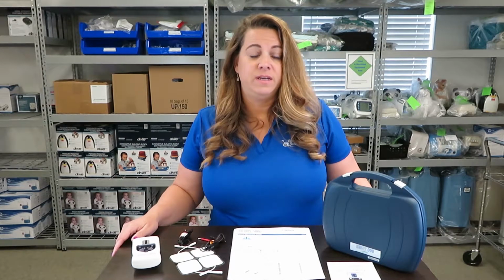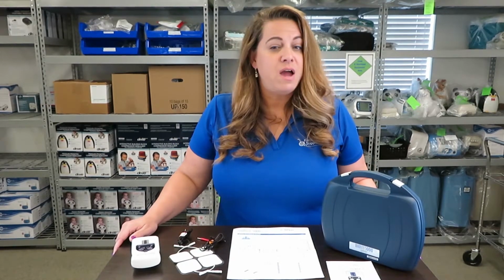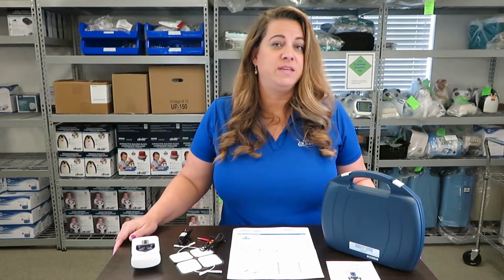Do not place electrode pads over open wounds. Do not place electrode pads over your chest. It may cause rhythm disturbance in your heart. And do not place electrode pads over your neck. This can cause muscle spasms resulting in airway closure.